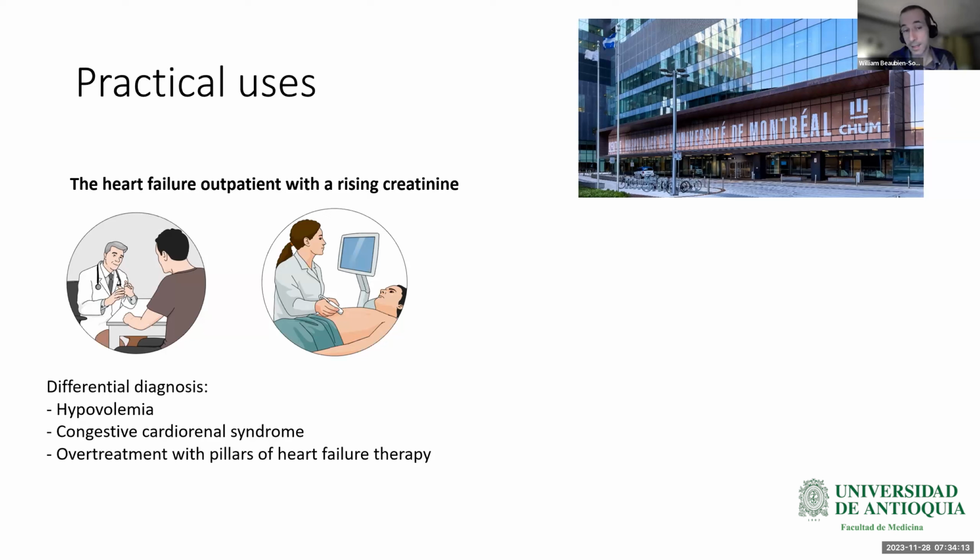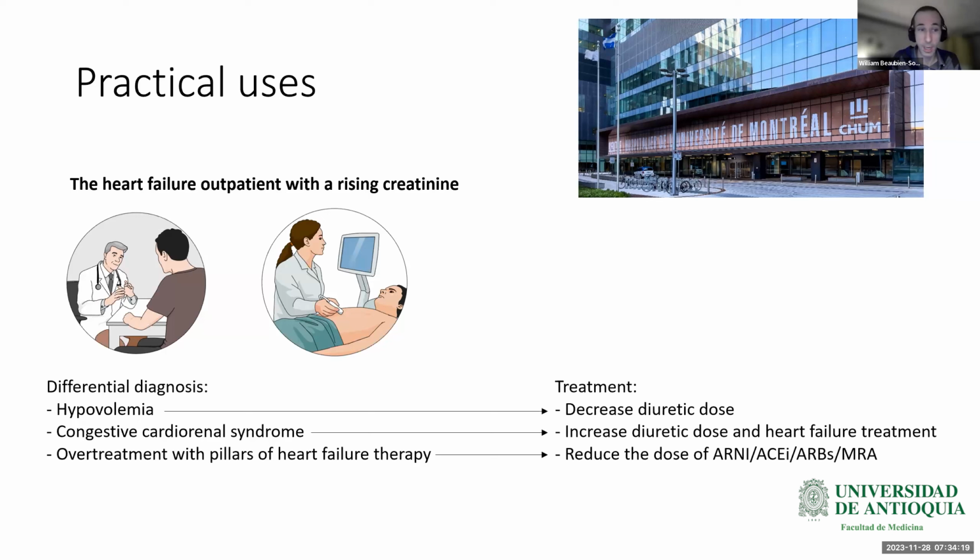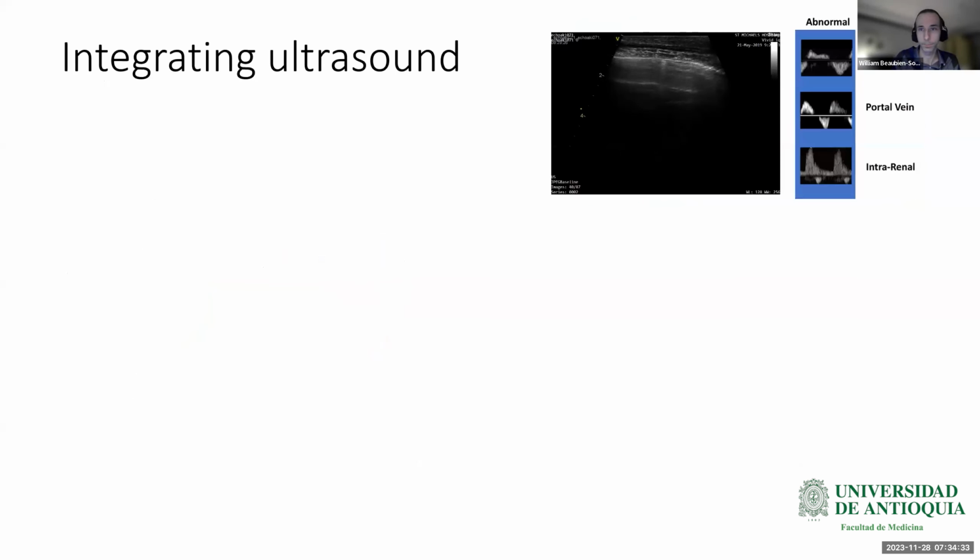That's when POCUS becomes very useful at the bedside, because it can differentiate between those causes and maybe orient your treatment, which will be different according to the mechanism that led to what we see on the laboratory measurement of creatinine.